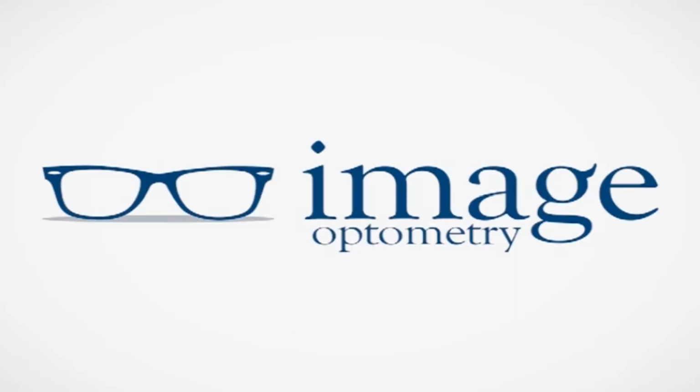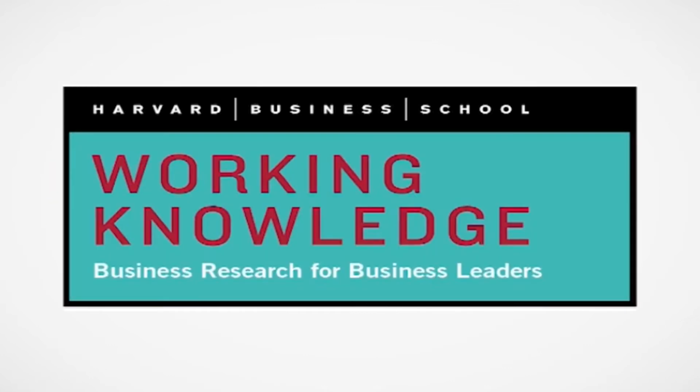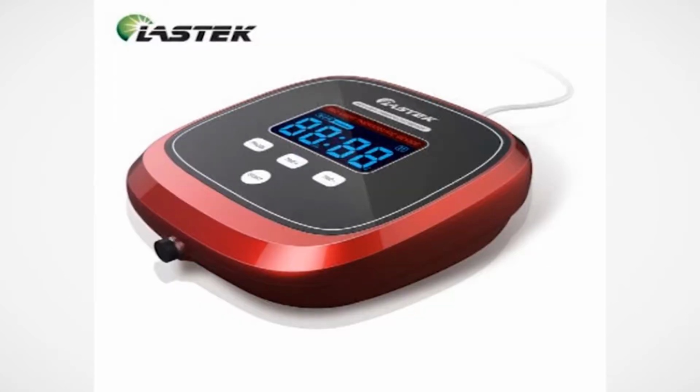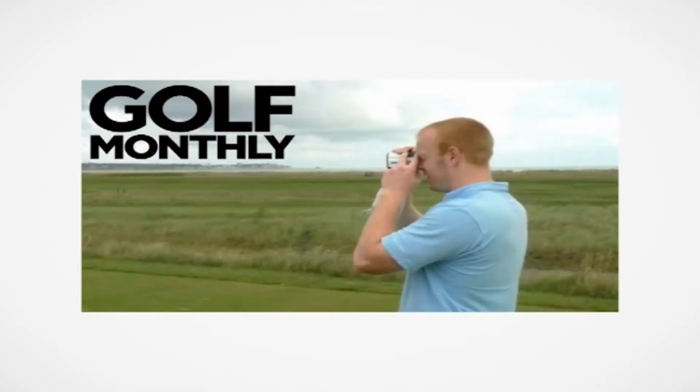Although low vision aids are dispensed after assessment by an ophthalmologist or optometrist, teachers can help students use them effectively. If the teacher has a working knowledge of the aid and its applications and a positive attitude towards its use, the student with low vision may be more comfortable using it. Optical devices are of two kinds: near and distance. Near devices are designed for magnifying close objects and print. Distance devices are for magnifying things in the distance from about 3 meters to far away.